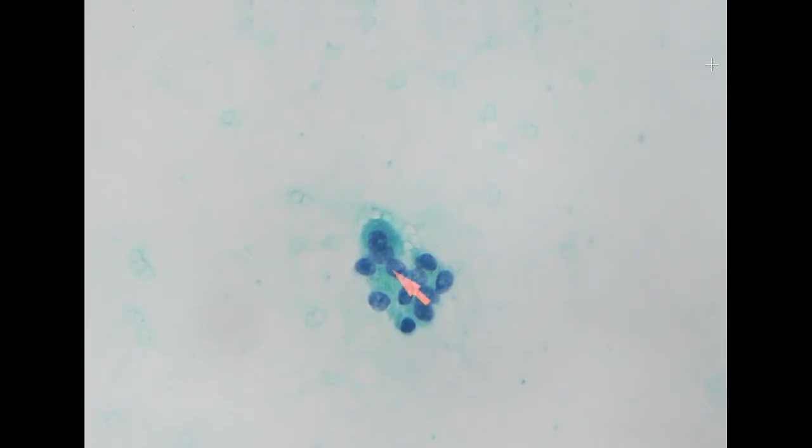Usually for the primary lung, we will see a bigger, larger cluster of the glandular cells. So these smaller rosettes, almost like a microfollicular pattern, are more consistent with prostatic cancer.